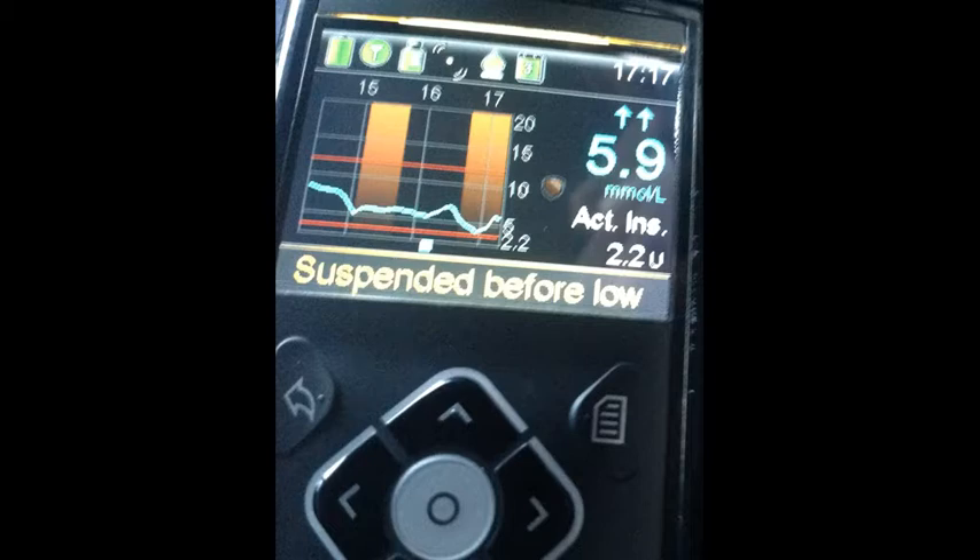This shot shows how SmartGuard kicked in twice during the day to prevent hypos. The CGM was on its way down towards a hypo around 3 in the afternoon. SmartGuard kicked in and the sensor glucose stayed nice and stable. After about 45 minutes the basal resumed. Then a bolus was given at about quarter past four, and you can see the CGM heading down to hypo again. SmartGuard kicked in about 4:45 and then kicked back in again about half past five. Suspending and restarting the basal for 45 minutes is sometimes enough to prevent hypos during the day.